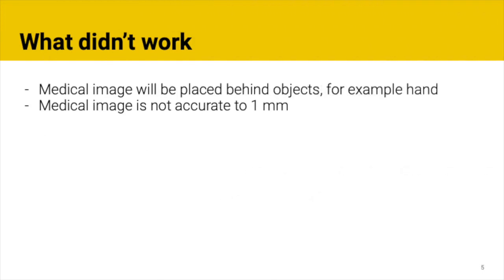Some important features that unfortunately did not work are the medical image appearing to be behind any real-life objects placed in front of it, and the placement of the medical image being accurate to 1 millimeter.